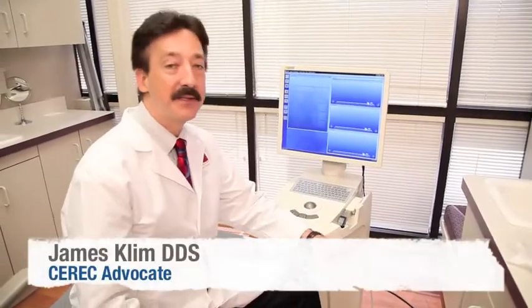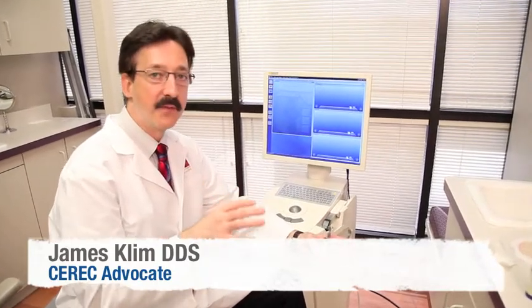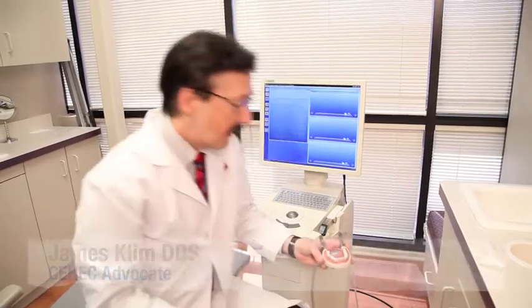So here's our CRX screen, our desktop, and I'm going to demonstrate the nice features, particularly the automatic capture feature and how effective it is to capture our restorations.